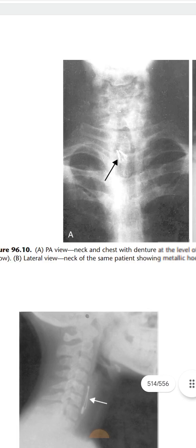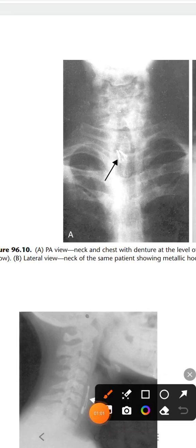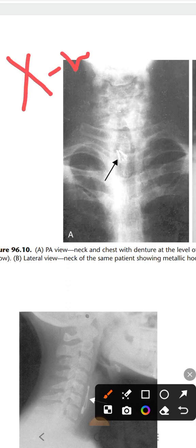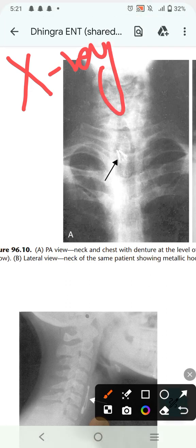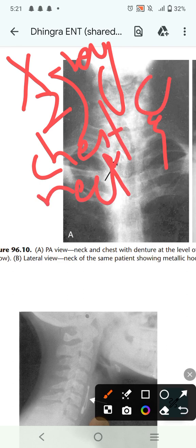Here is the PA view. Before going to the PA view, I must tell you the protocol for writing your answer in your exam. First, write that this is an x-ray. Second, write which region is shown — for example, 'x-ray chest' or 'x-ray chest and neck' if both are shown.